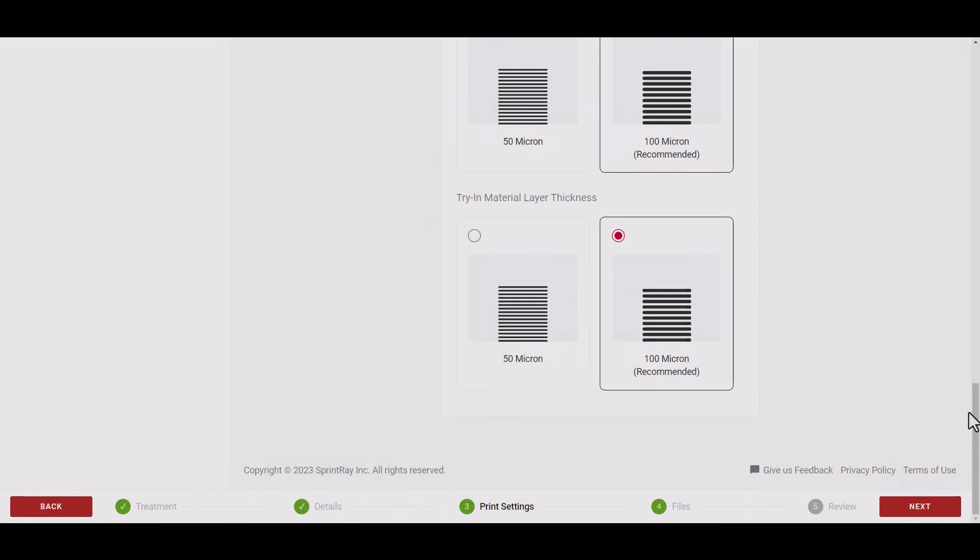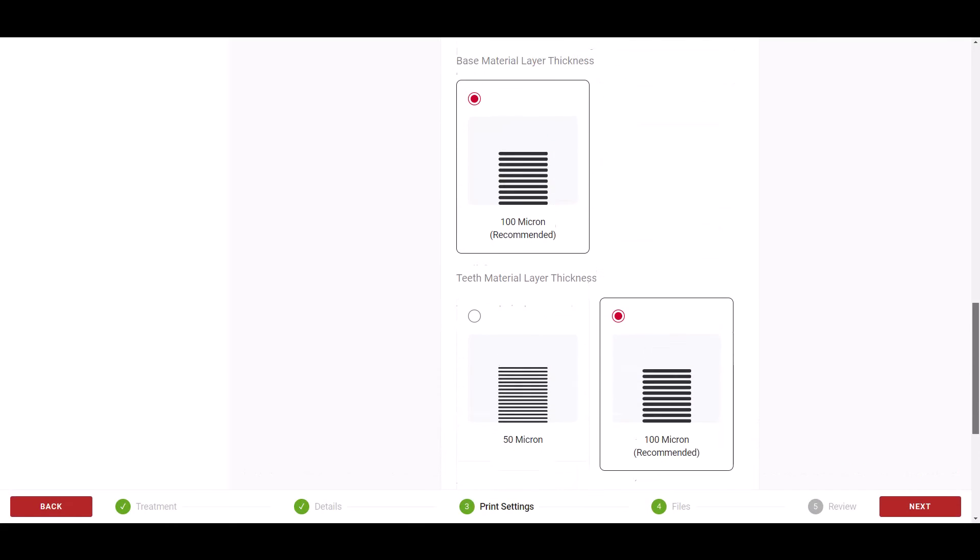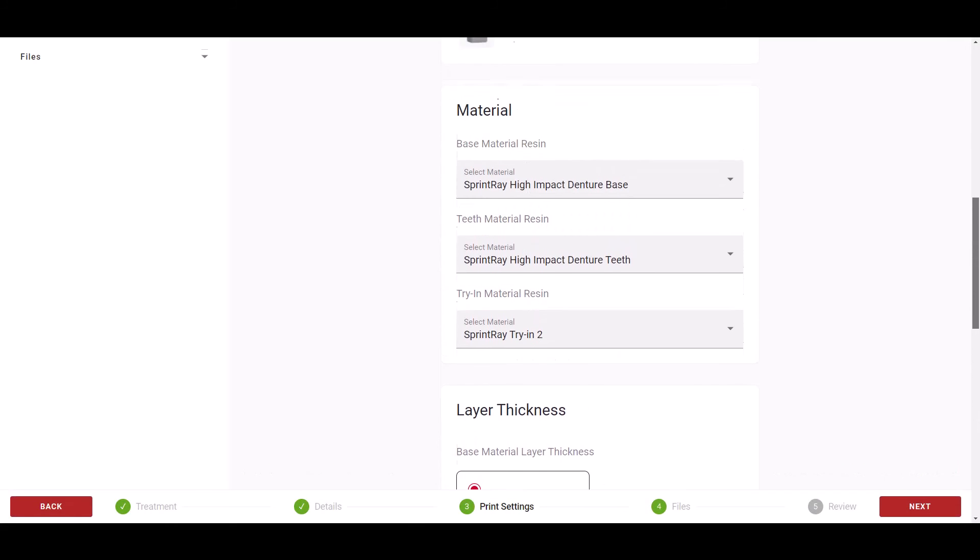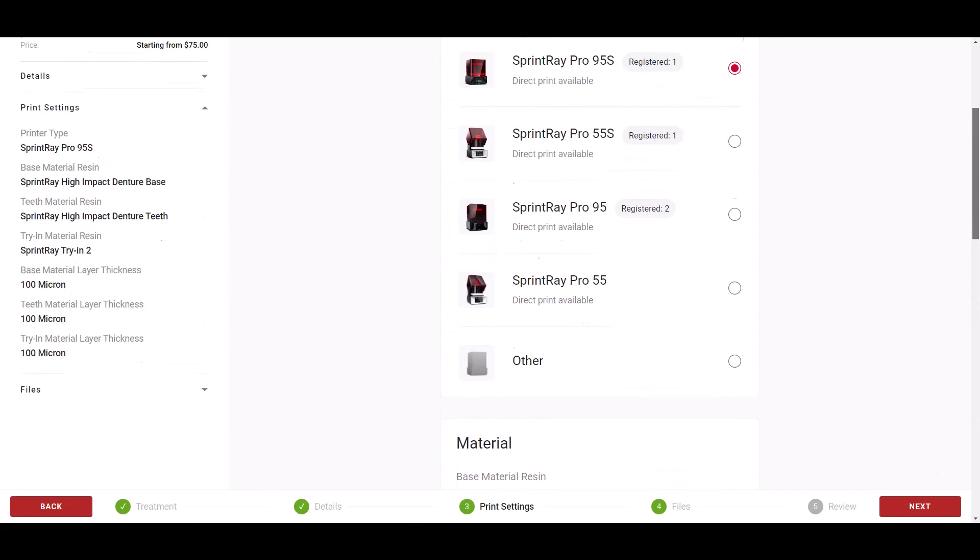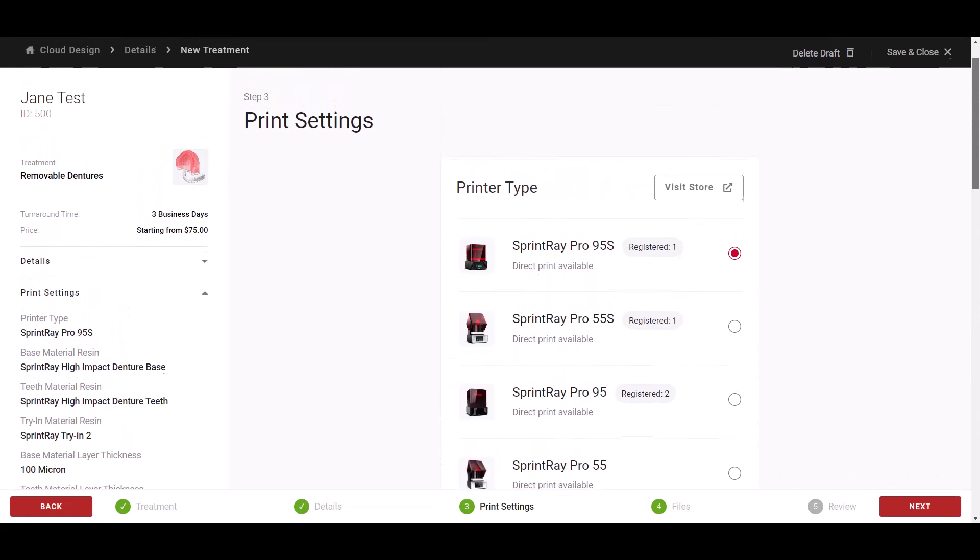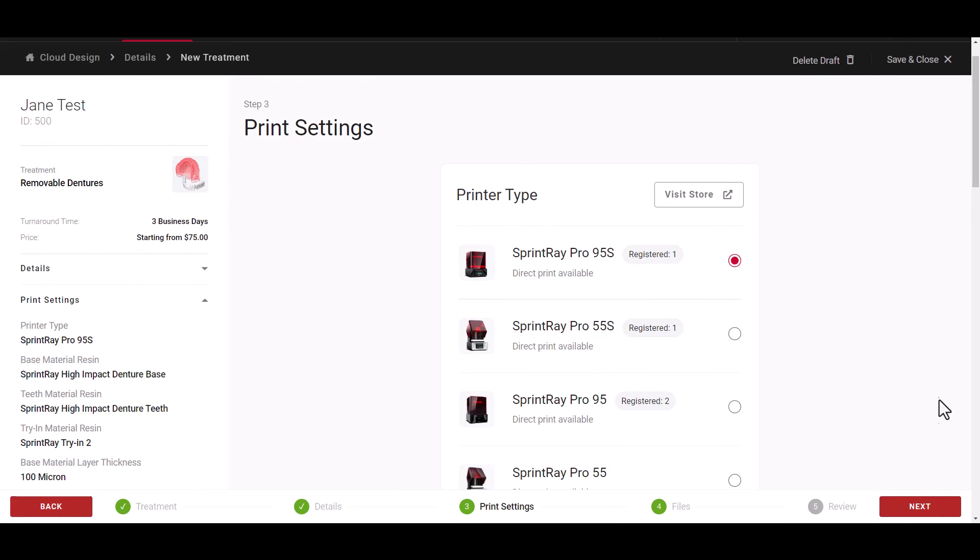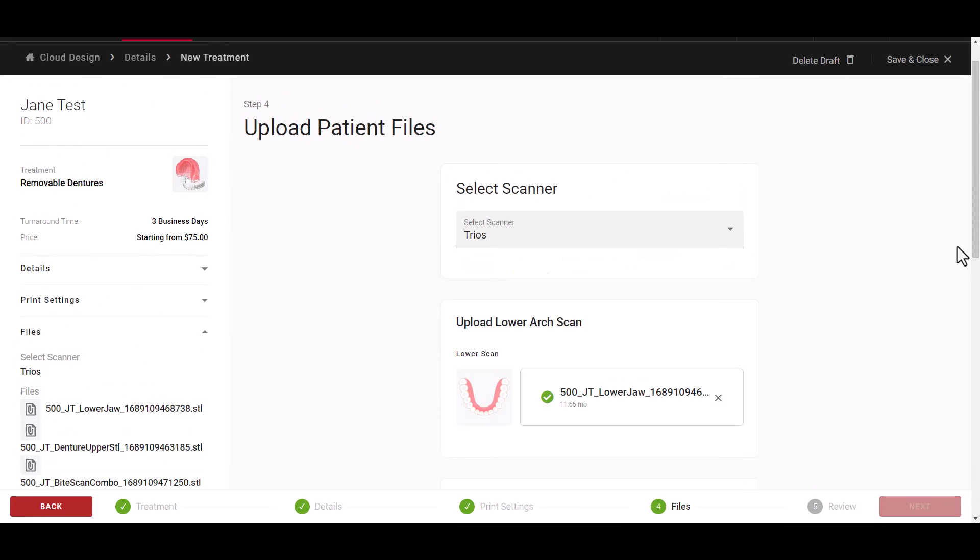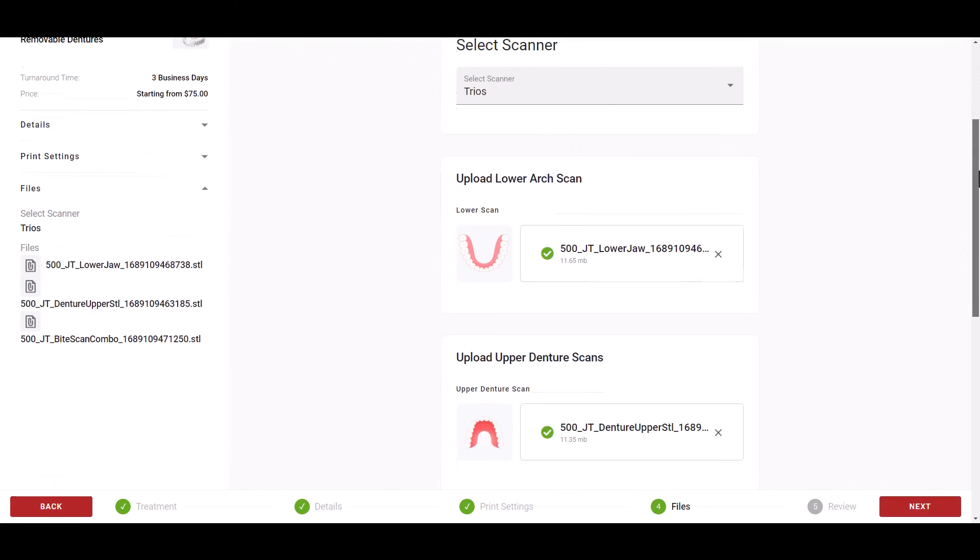Once you have chosen your preferred denture style, proceed with the normal treatment submission process by choosing your print settings and uploading your patient specific files.